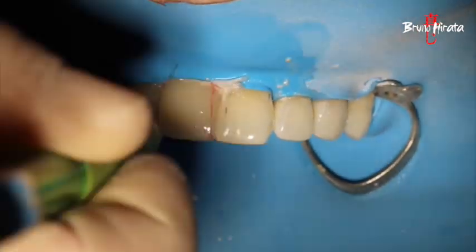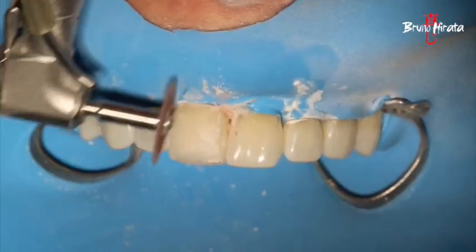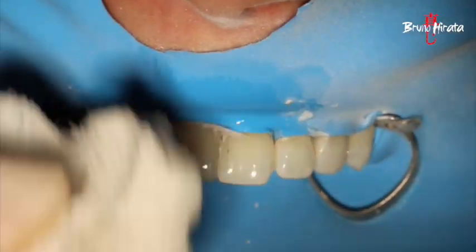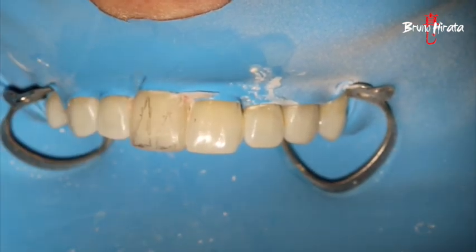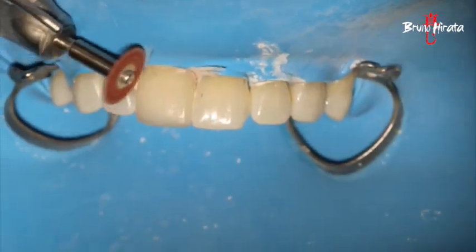The facial proximal transition line angles are outlined with a pencil to establish their ideal position. For the anatomy details, we can create depressions and perikymata with multi-fluted carbide and fine diamond burs.